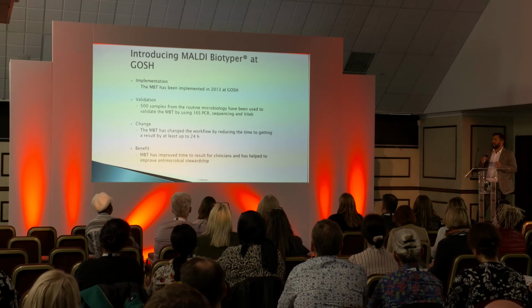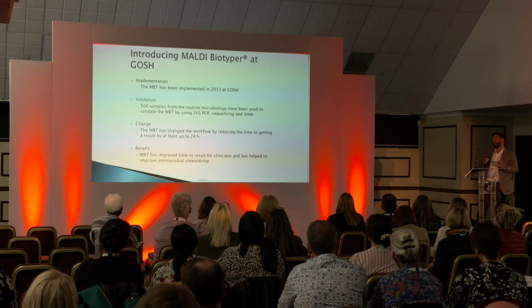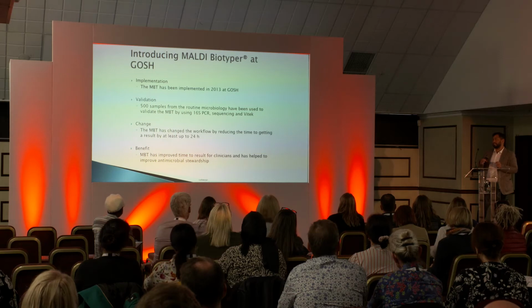We used to use a Vitek, which is another diagnostic instrument for ID, and compare that to it as well. And actually, we were very happy with the result, and so we were happy to move over and sign off that validation to implement the Maldi-TOF into the laboratory.